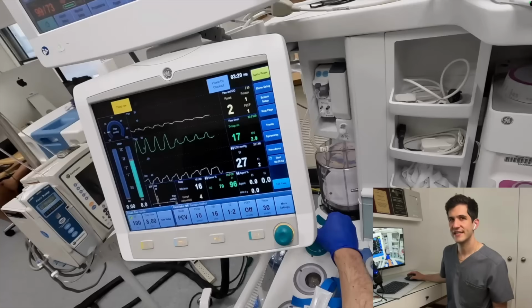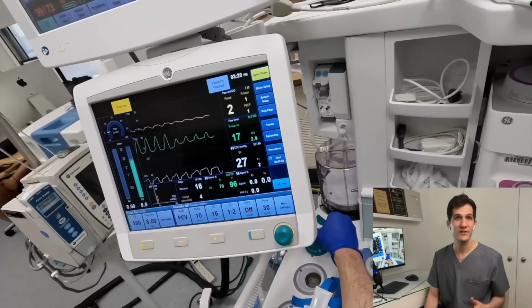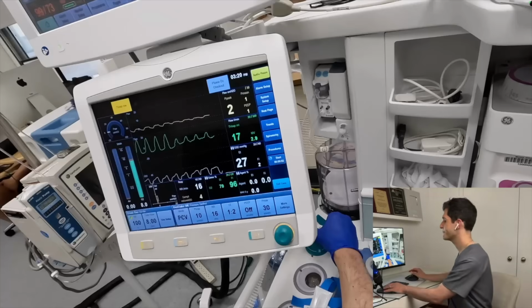That move that I just did there is called closing the APL valve, which basically increases the amount of pressure that I'm delivering through the anesthesia circuit. So this is delivering continuous positive airway pressure, which is another maneuver that's designed to break laryngospasm, which is what I'm starting to suspect might be happening based off that inspiratory stridor and then also the fact that the flows have gone down.